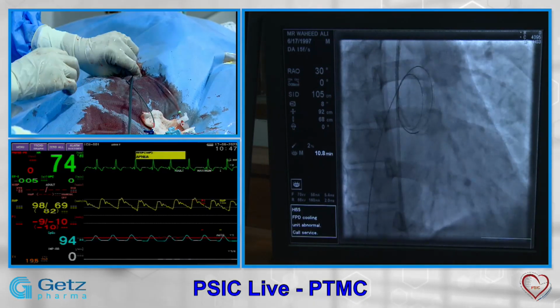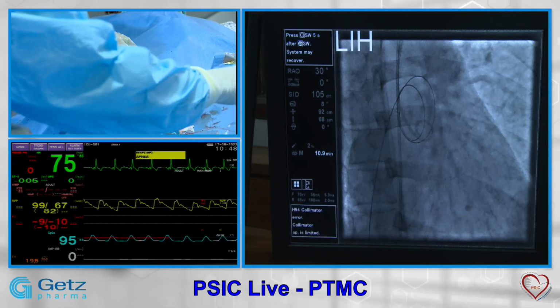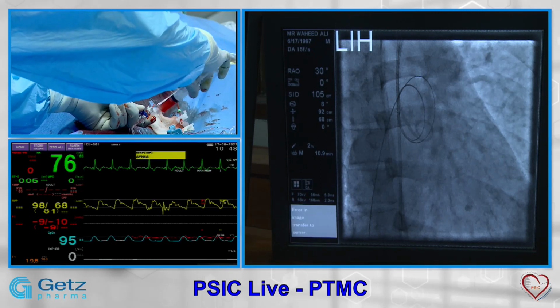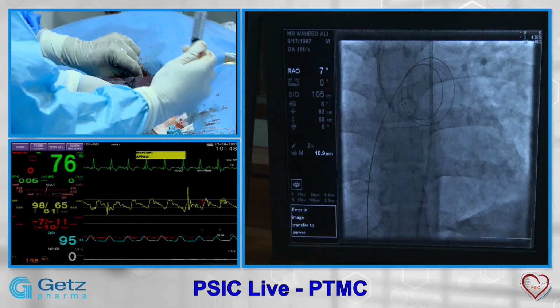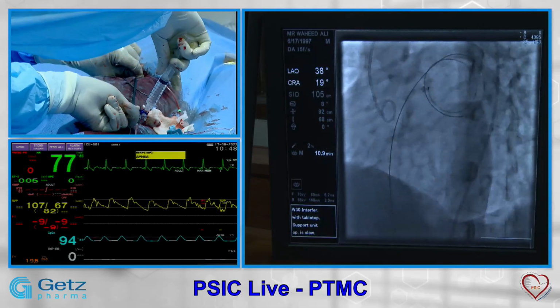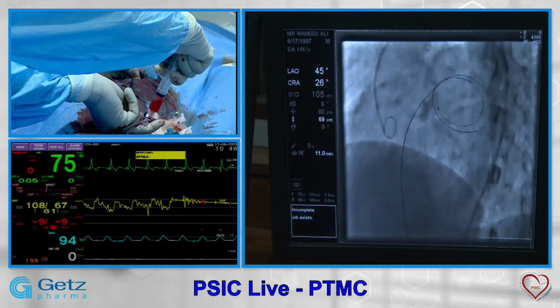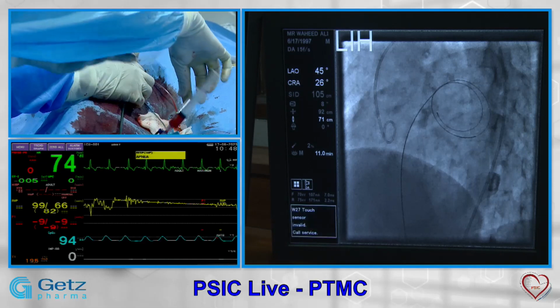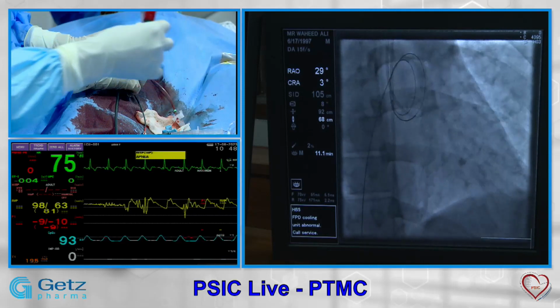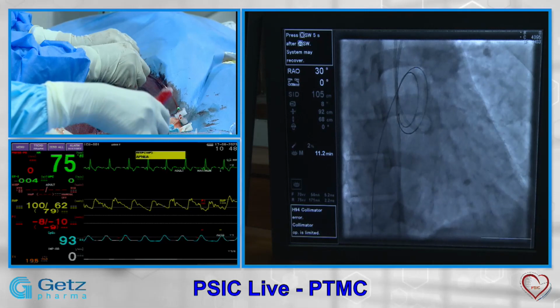Sometimes you are not sure whether we are in the LA or in the RA. The conventional teaching is that you can go into the left anterior oblique cranial view. Can you please go to the LAO cranial? This one will confirm, because LAO cranial is our 4-chamber view on echo. So you can clearly see we are resting in the LA. And can you please come back? And then please hold the wire. Now we'll dilate the septum.